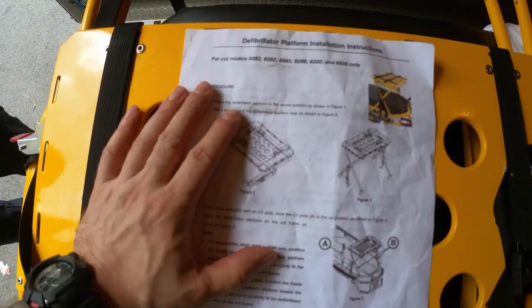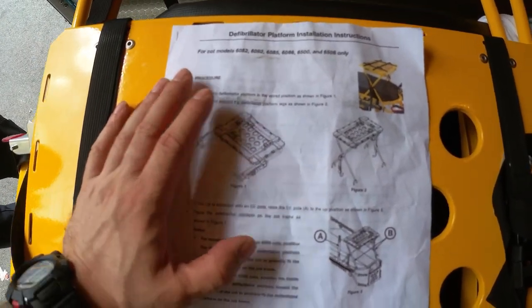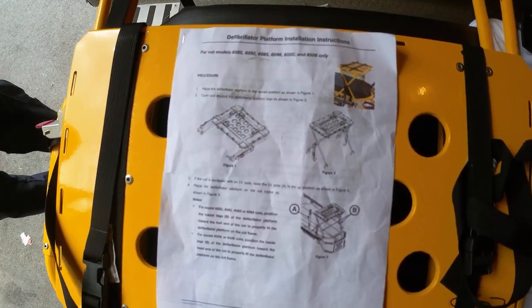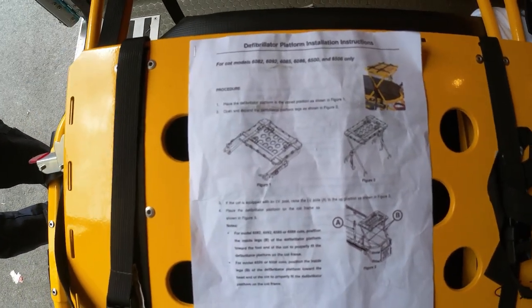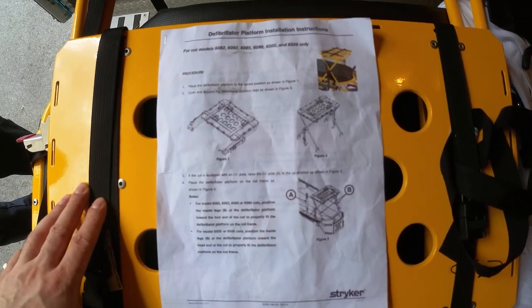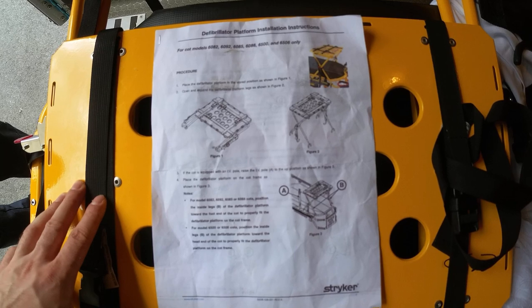In this video I want to show you how to mount the defibrillator platform to the stretcher and go over some of the important features of this device and how to do it properly so that all the equipment is fastened securely and you're not going to have damage to the equipment or any injury to your patient.